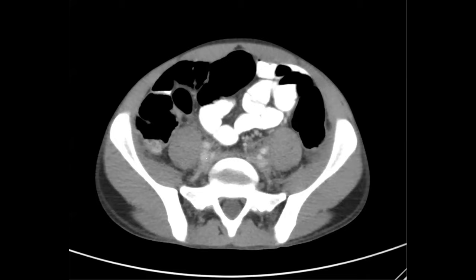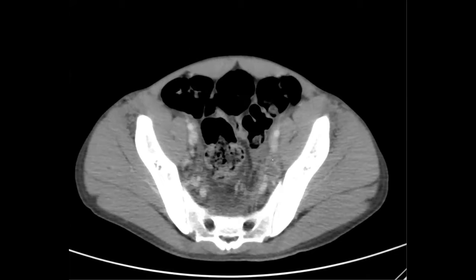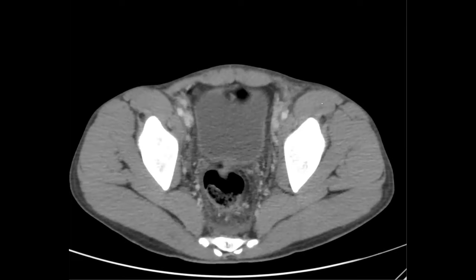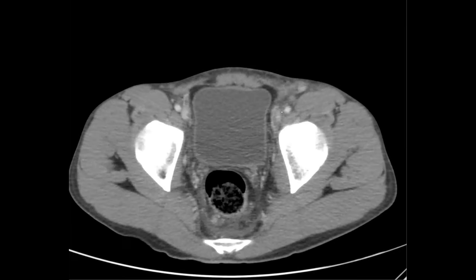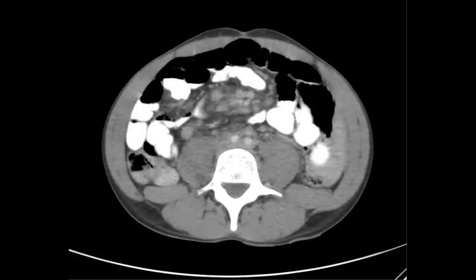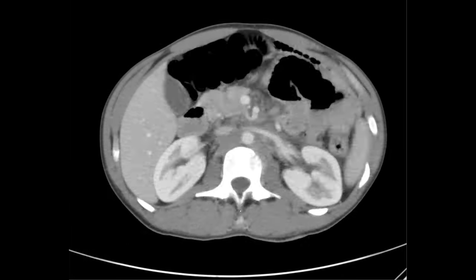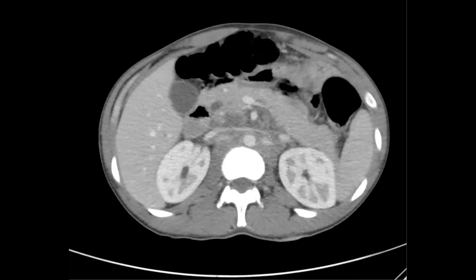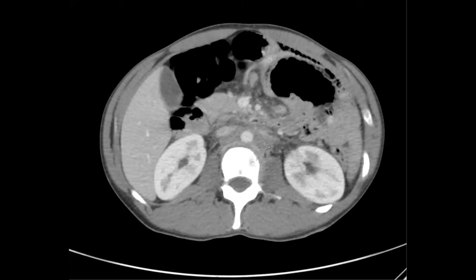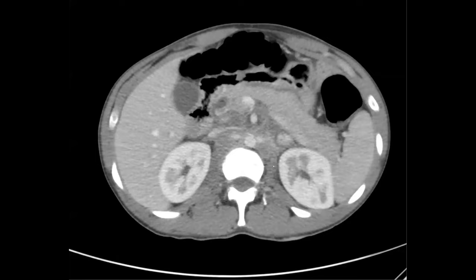And the soft tissue is kind of going along the vessels, losing the fat planes also in the external iliac region as well. So any thoughts about this? Is this retroperitoneal fibrosis? That's a great thought. So one thing that goes against it is that you would think that the ureter is going to be somewhere here and they're not obstructed. This was not retroperitoneal fibrosis in the end.